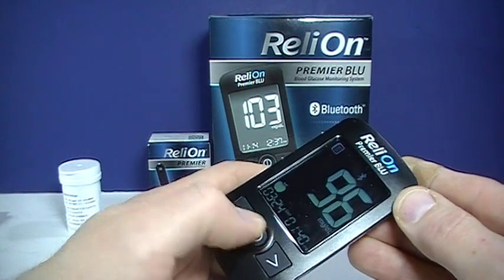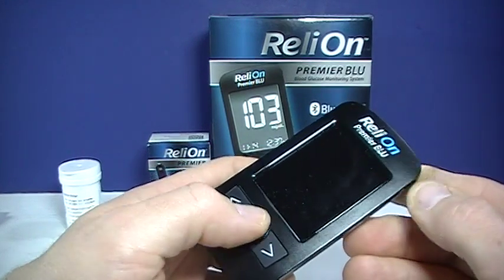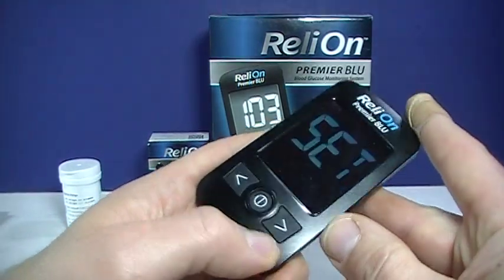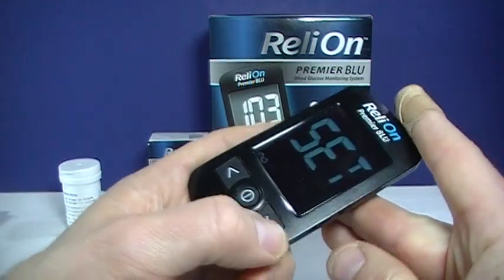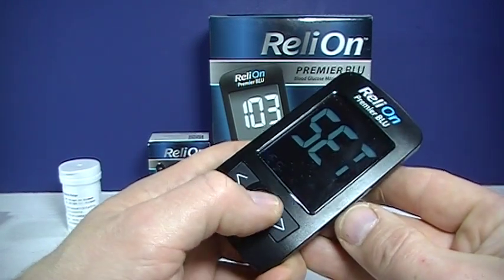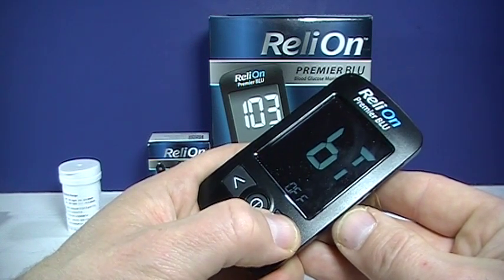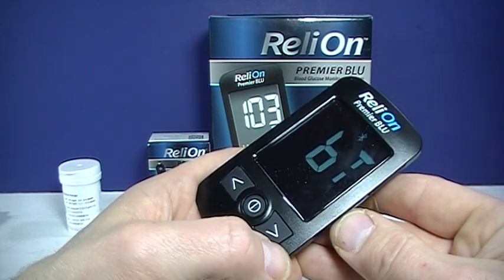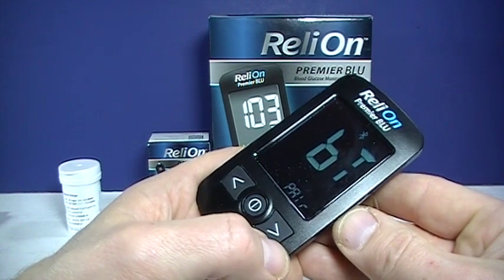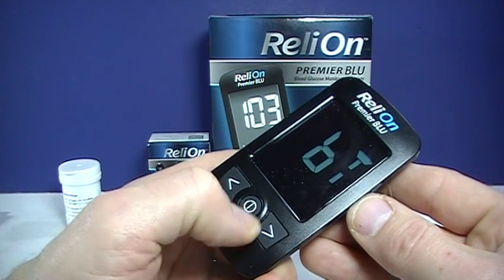Another important option when using this meter is setting the time. You want to hold the power button down until it's saying set. At this point, it's prompting no, and we will want to push the arrow button. Now it says yes — we want to set that meter up. The first one would be for Bluetooth. You can turn it off, on, or you can do your initial pairing with the app. We'll just leave it off and go on to the next.